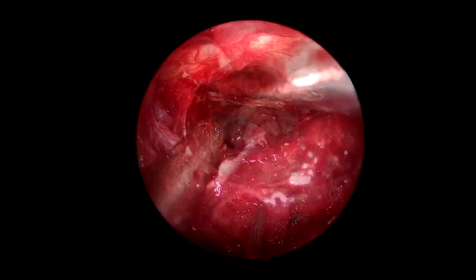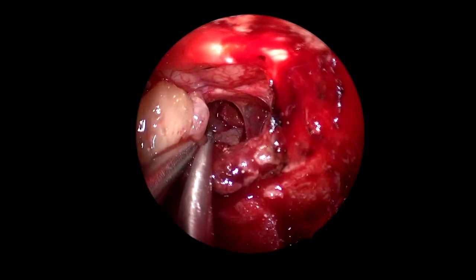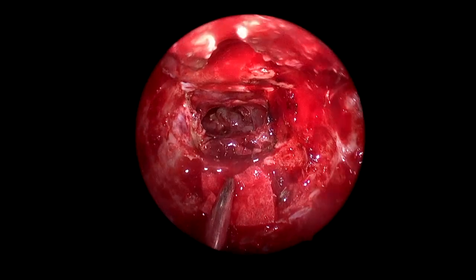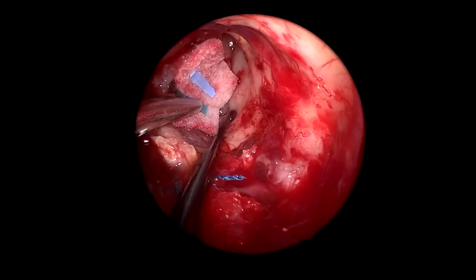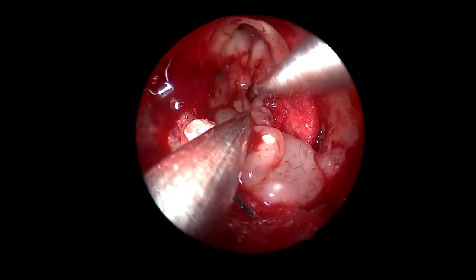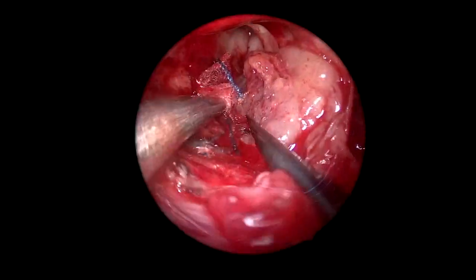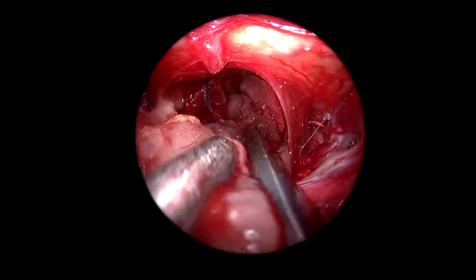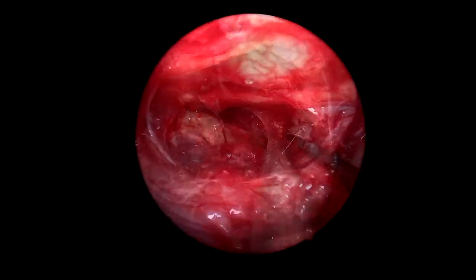Attachments superiorly are not so concerning. The concern is the attachment at the floor and inferior walls of the third ventricle, where the hypothalamus is located. These have been detached and I continue dissecting the remaining capsule. We can see the foramen of Monro superiorly with the thalami. There is a small attachment to the thalamus — this is not tumor origin, just capsule attachment — and it can be dissected easily. I keep working to bring the whole tumor cyst capsule down.